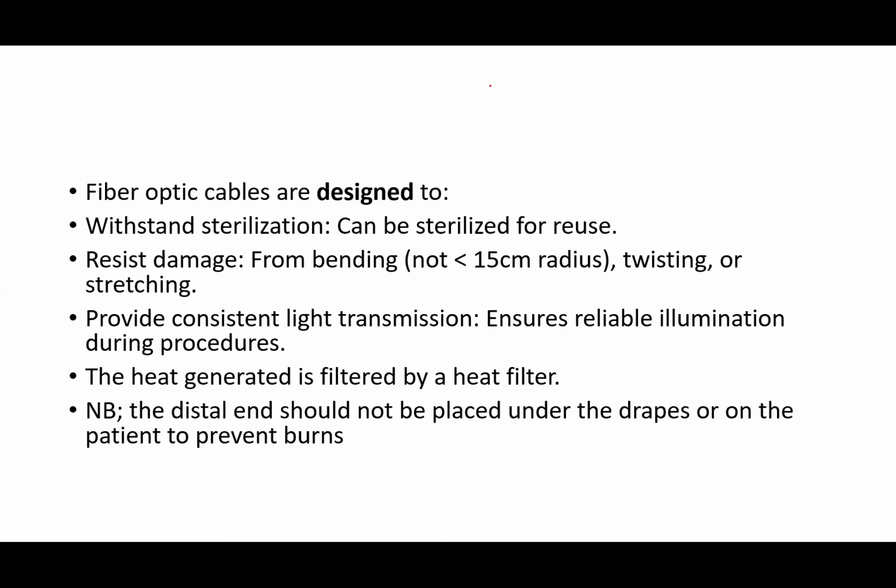But the most important precaution you take when handling the fiber optic cable is not to fold or bend at an acute radius of less than 15 centimeters, because it's going to destroy the fiber optic cables within. It provides consistent light transmission, which ensures reliable illumination during the procedure.